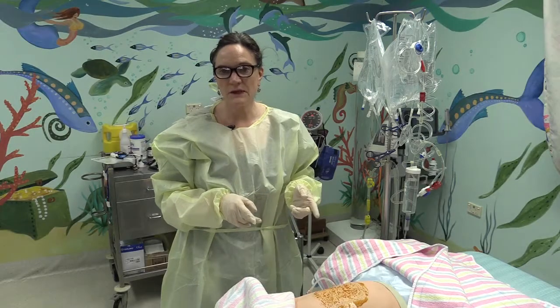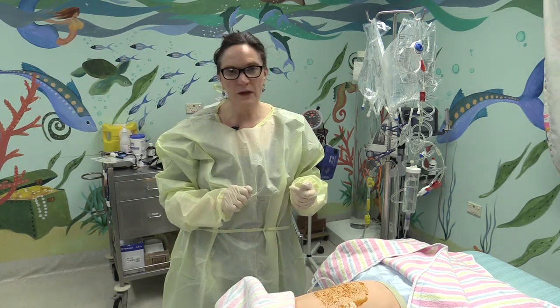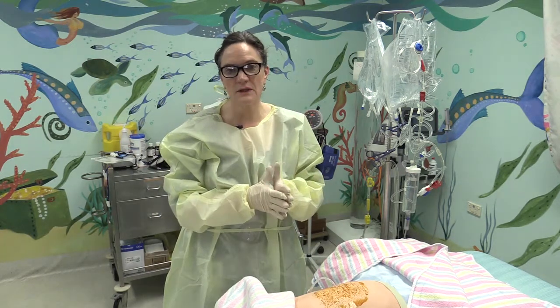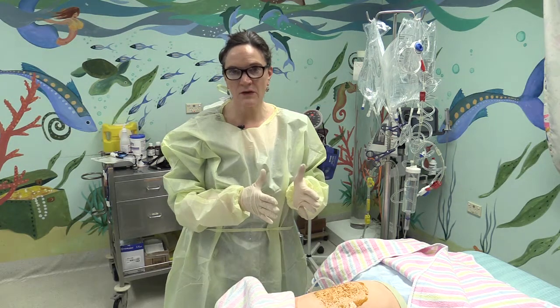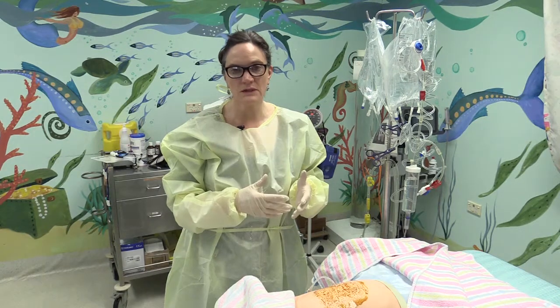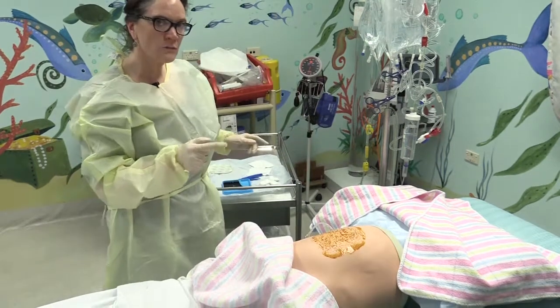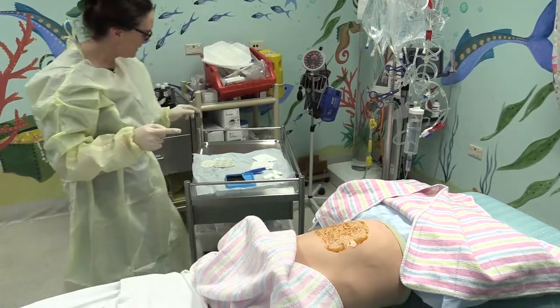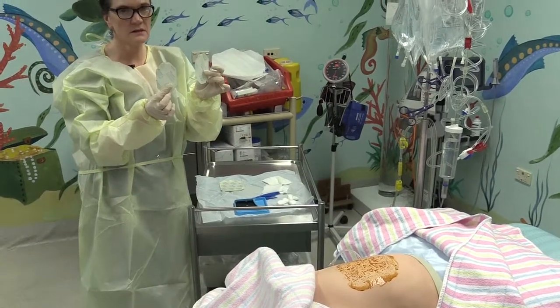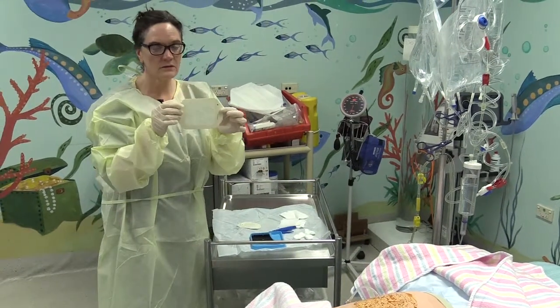Once the catheter has been inserted, we need to apply a dressing. We will apply a sealed dressing, so we're going to envelope it within 2 transparent sterile dressings so that the catheter is sealed and air and water tight. We're going to use Tegaderm, and the equipment that we require for the dressing are two small Tegaderm dressings and then a larger one.